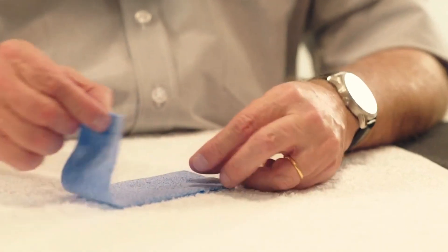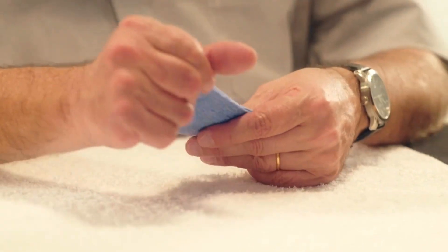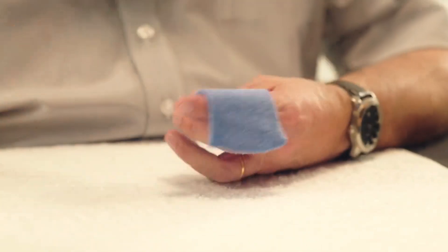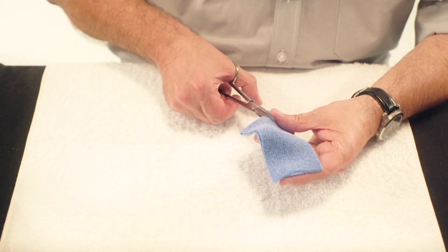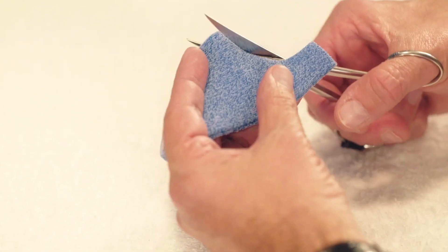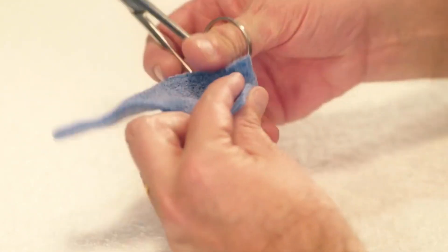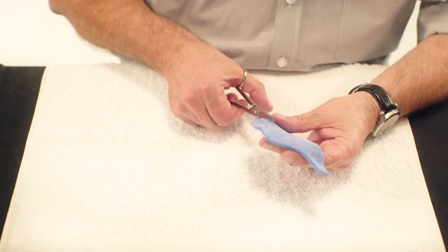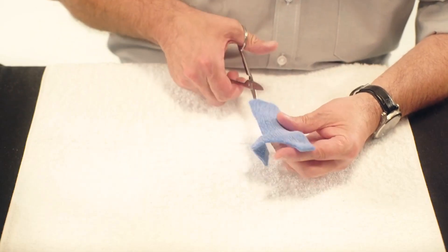Step 2. Heat the second large strip and fold it in half. Cut away a portion creating space for the thenar eminence. Cut into thirds creating a narrow strip for each of the three fingers.